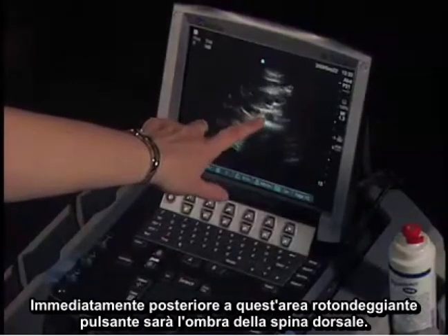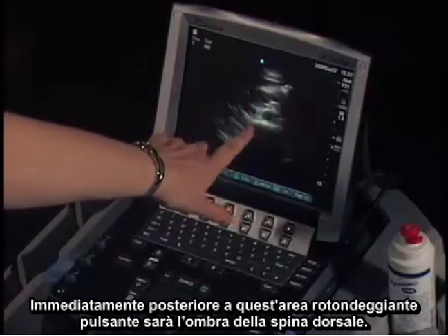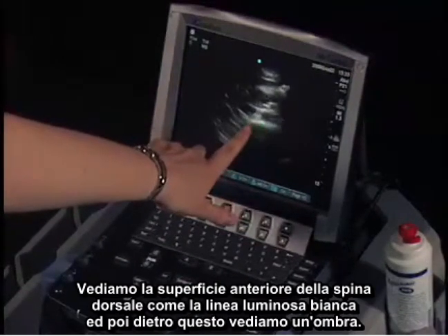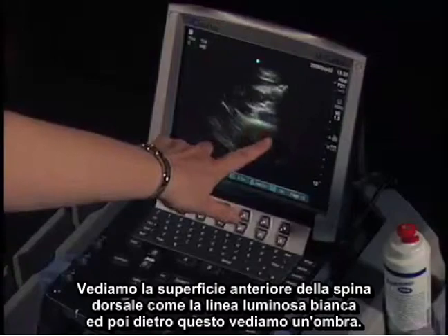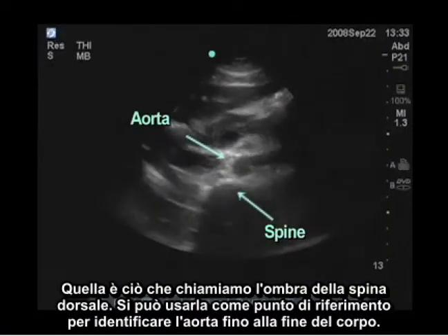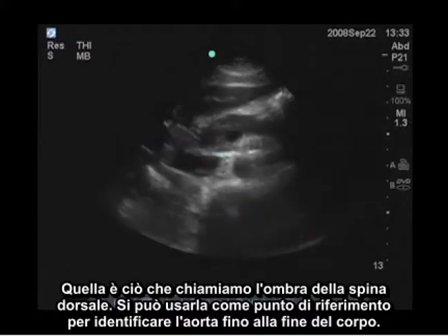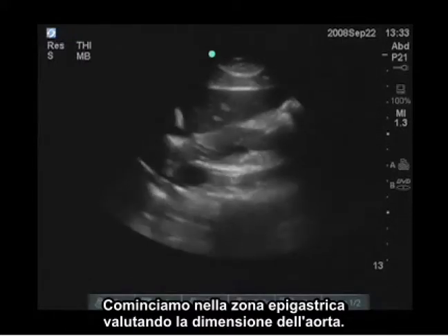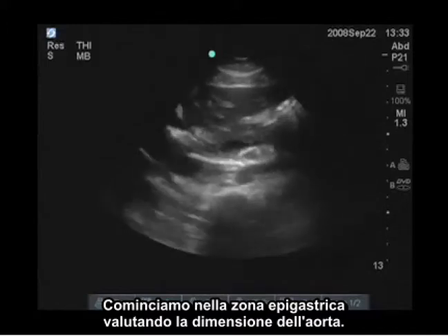Immediately posterior to this round pulsating area will be the shadow of the spine. So we just see the anterior surface of the spine as the white bright line, and then behind this we see a shadow. That is what we call a spine shadow, and you can use that as your landmark to identify the aorta all the way down the body. So we're going to start in the epigastric area, assessing the size of the aorta.